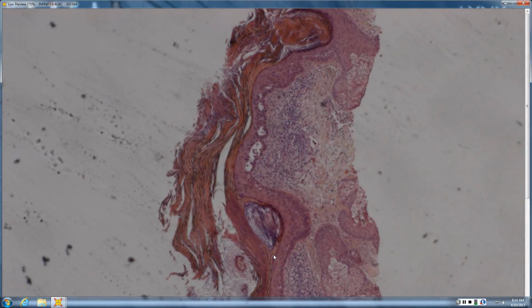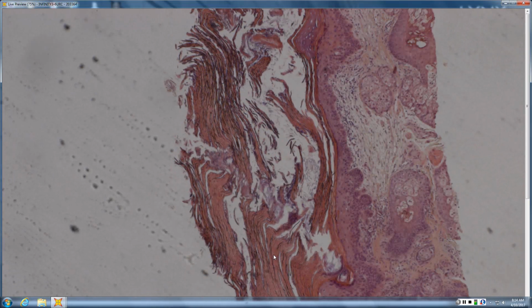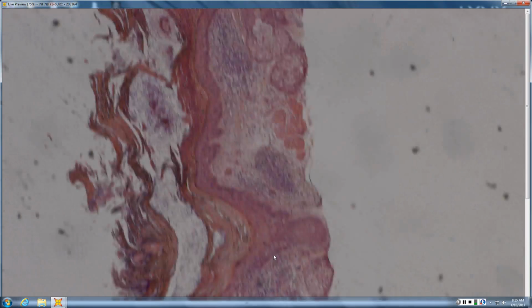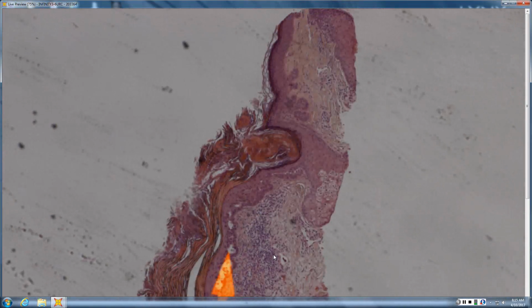Definitely hyperkeratotic. There's definitely AK in there. It's definitely AK. You see an actinic horn, red with vertical blue, horn, budding. And then the question is, is there anything other than AK? Probably not. And the AK is acantholytic. Okay, very good.